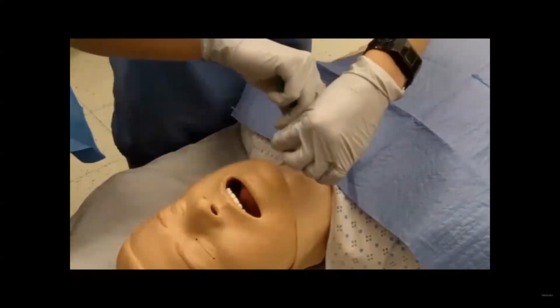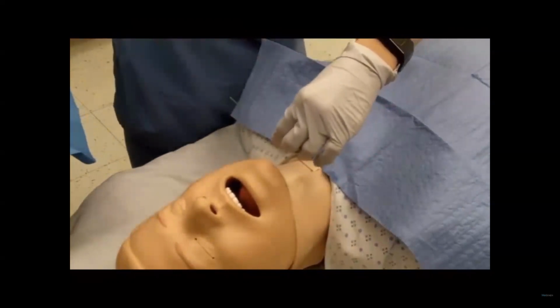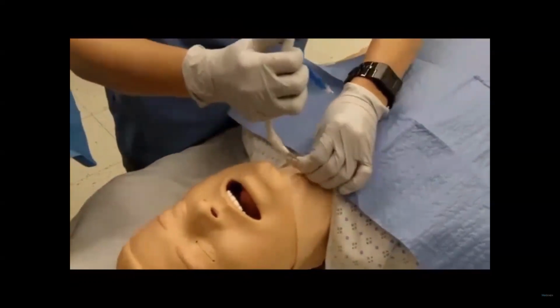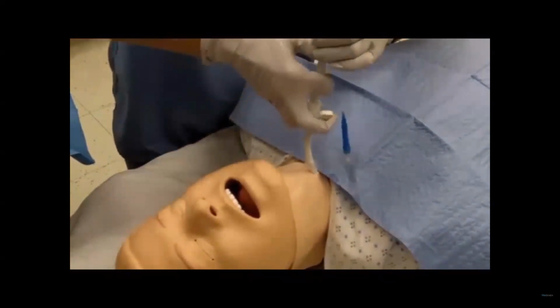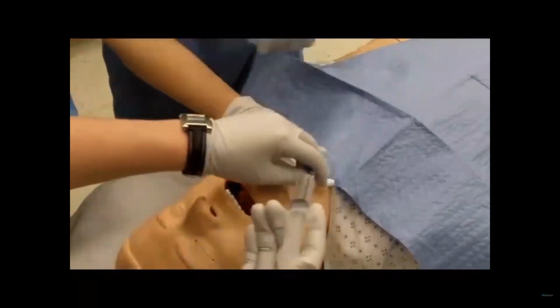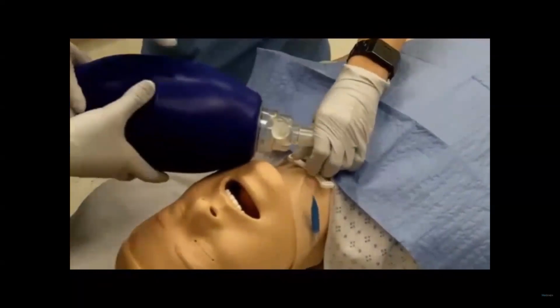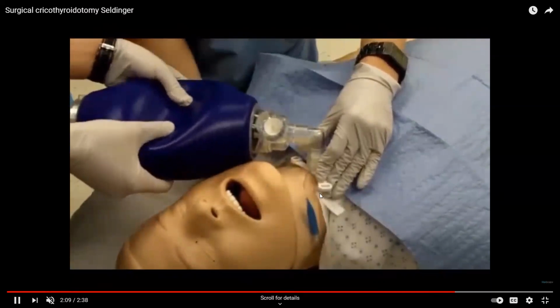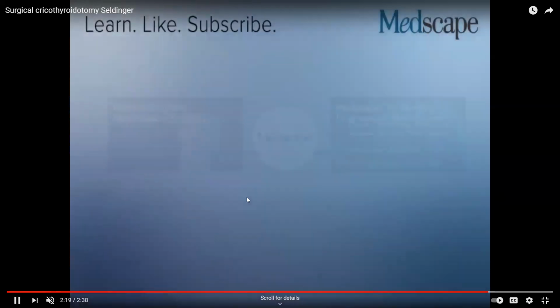You can see they removed the needle, have the wire in there. They're making the incision with the 11 blade. I believe they made theirs vertically. I would suggest a horizontal. And then here's the dilator within the appliance. And so they removed the wire and the dilator, inflated the balloon, and are ventilating the patient. So they have the ties they're going to be using, or suturing, or however you're going to secure the thing.